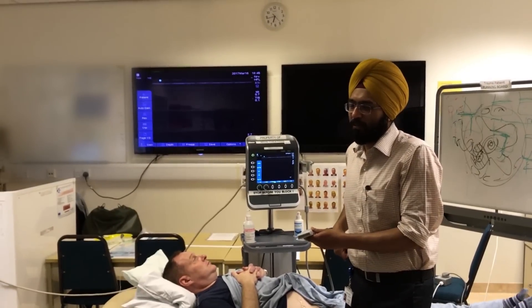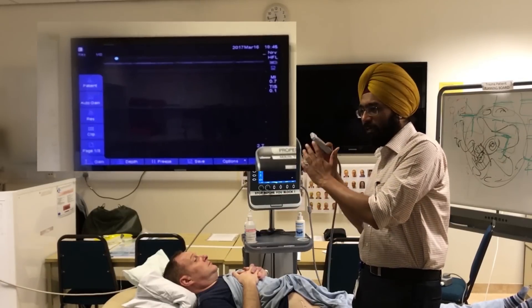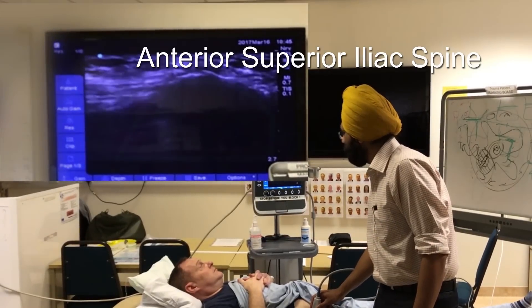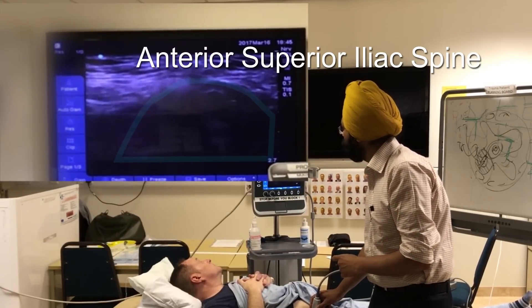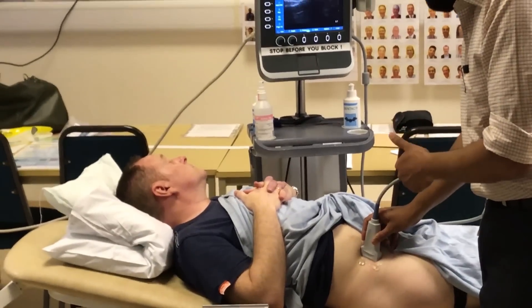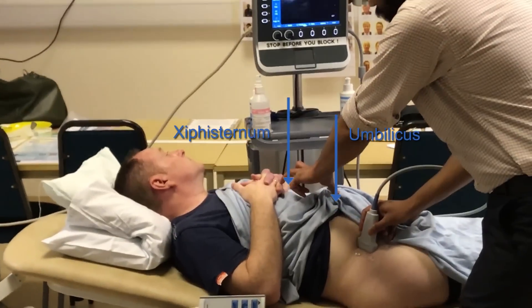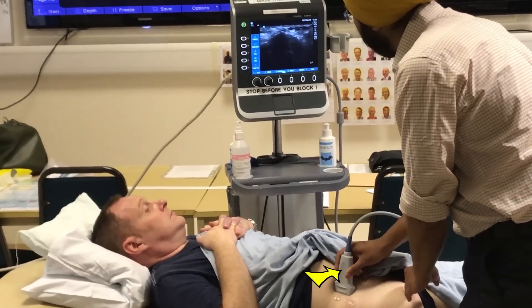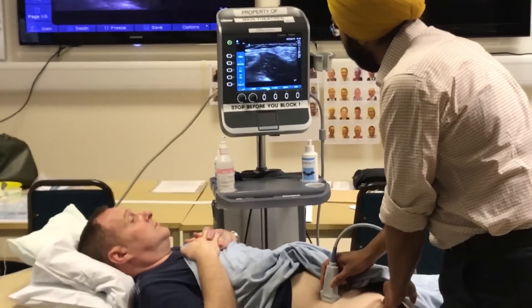You should be able to see that structure - it's about half a centimeter from the skin. With sound waves, anything that absorbs a lot of sound waves is going to look black. You see a hill-like structure right under the skin - that's the anterior superior iliac spine. Put your probe there pointing midway between the umbilicus and xiphisternum, then move the probe in the same angulation until you come across a pattern something like that.